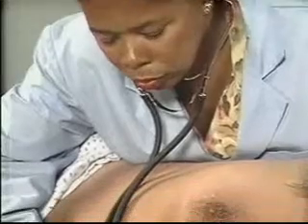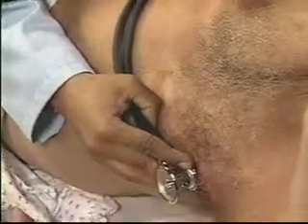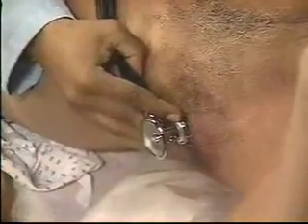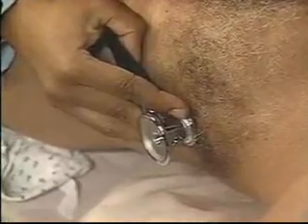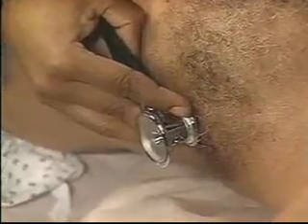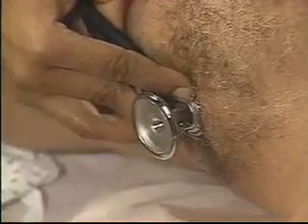If the patient had an audible S3, it would sound like this. Now, notice how the third heart sound disappears when the bell is placed more firmly on the chest wall.